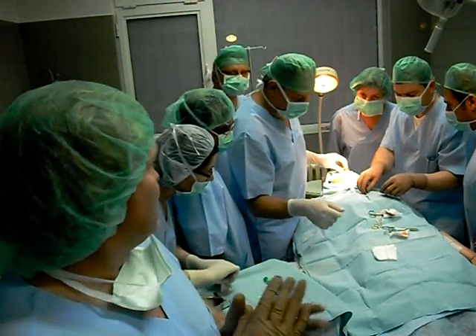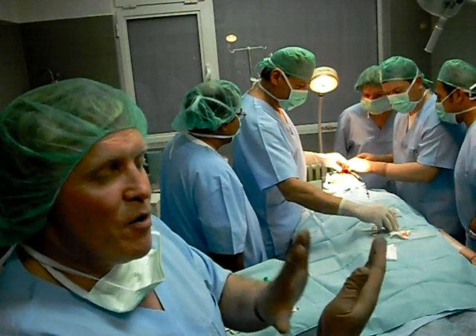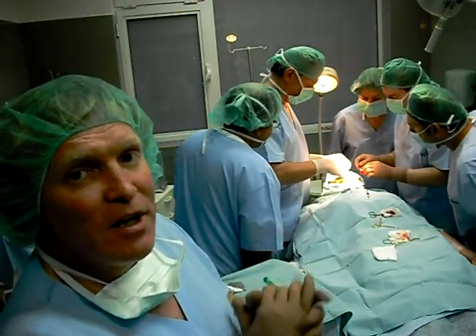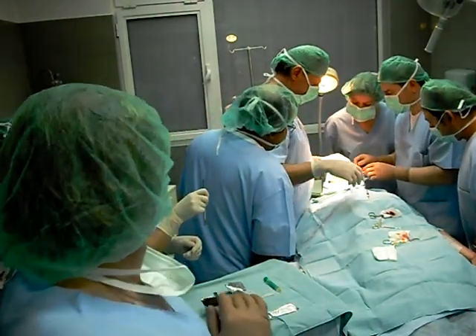The second part of the procedure involves what we call rotation. And after rotation, we have suturing, where the opposing aspects of the cartilage are brought together.